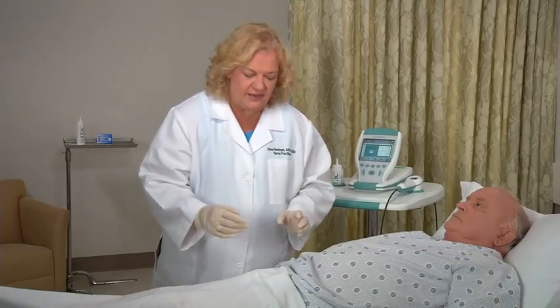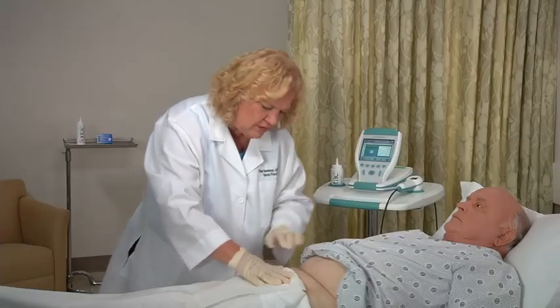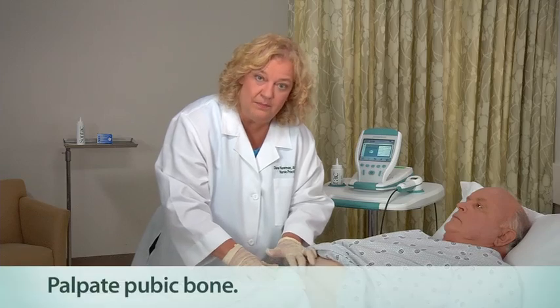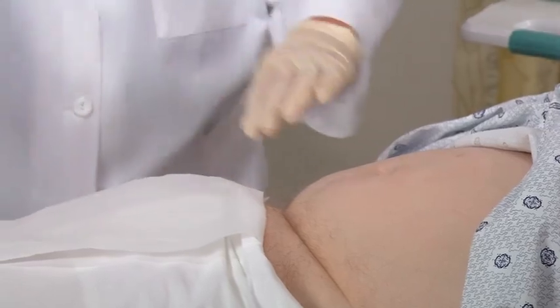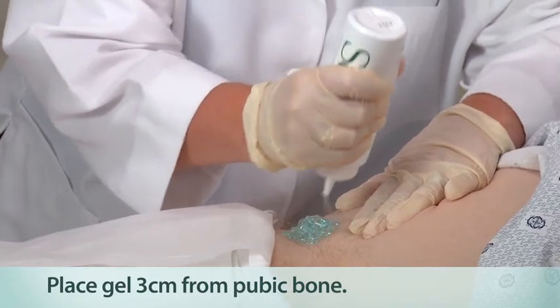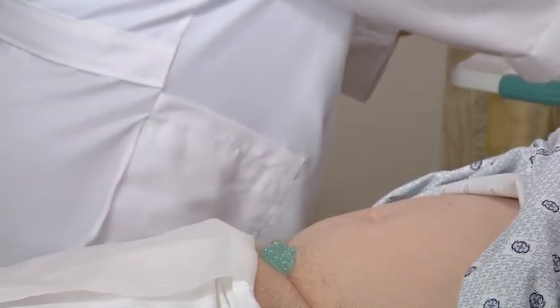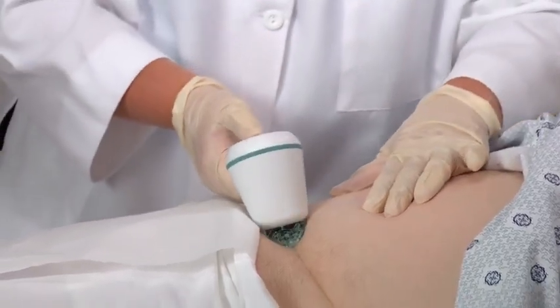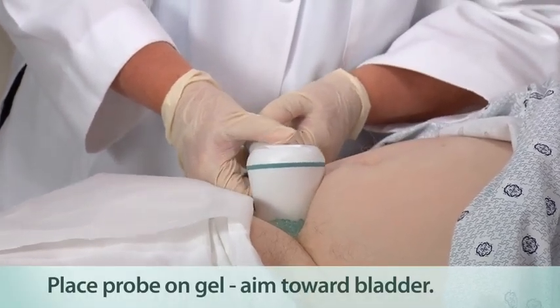Before you do the scan, you want to visualize the area that you're going to scan. You want to locate the pubic bone because you're going to scan above it, so palpate that area. Next, place a generous quantity of gel midline of the patient's lower abdomen, about one inch or three centimeters above the pubic bone — a generous amount will make your scan more accurate. Standing alongside the patient's right side, place the probe on the gel and aim it downward behind the pubic bone towards the expected location of the bladder. Press and release the scan button located on the underside of the probe.